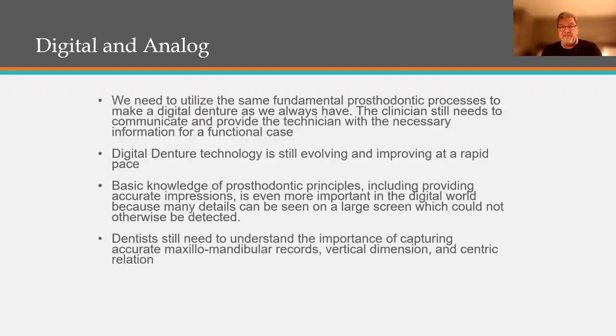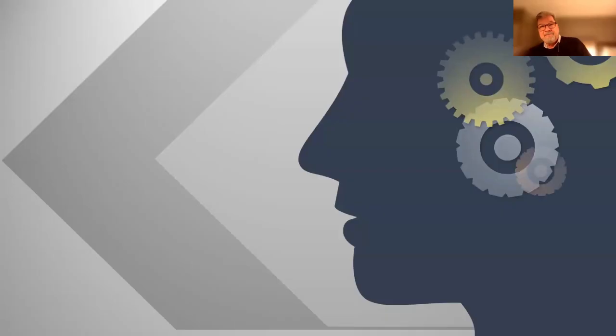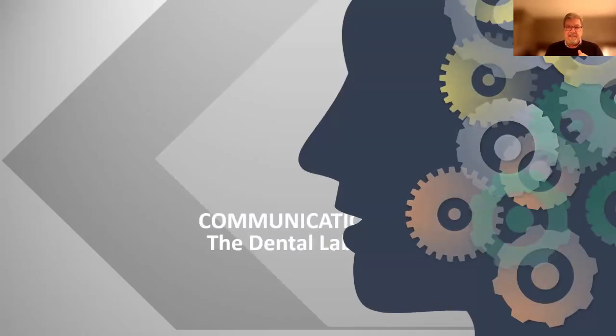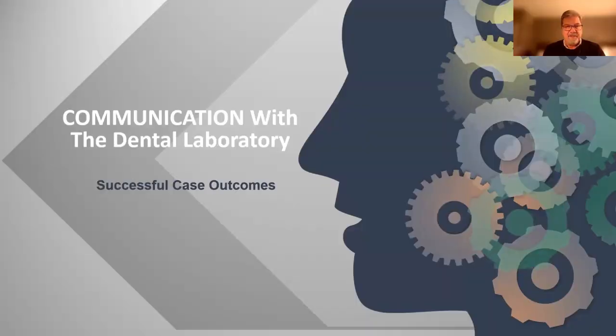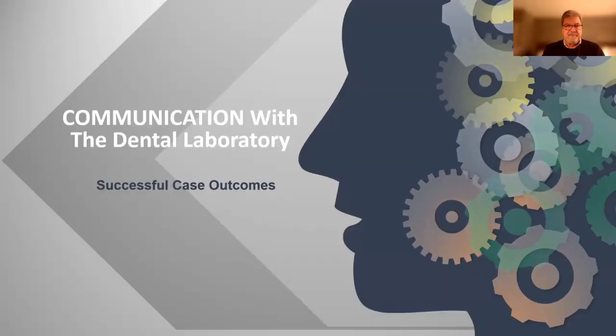Dentists still need to understand the importance of capturing accurate maxillomandibular records, vertical dimension, and centric relation. And technicians still need to continue to analyze ridge relationships and select appropriate anterior and posterior teeth for the desired occlusal scheme. So this is where communication comes in, the communication between the dental laboratory and the dentist. It's really essential, especially with implant cases, to have that correct communication for the proper planning of cases.